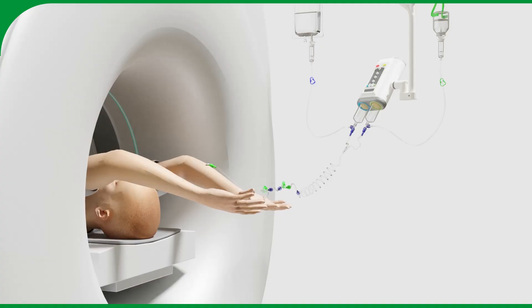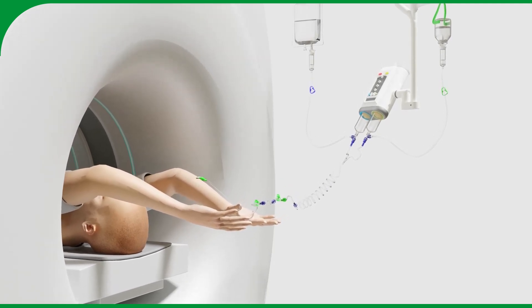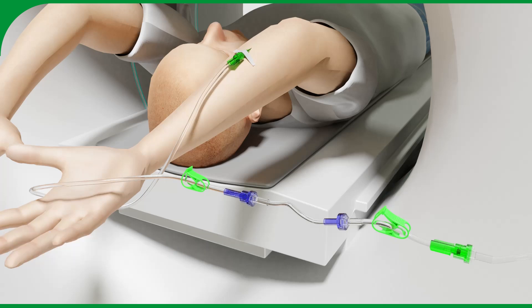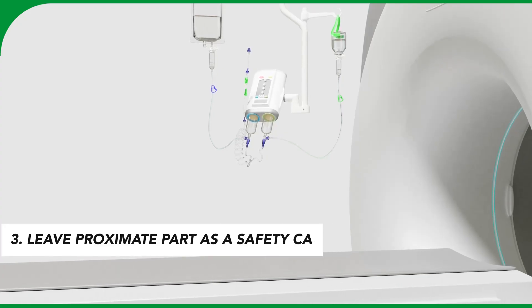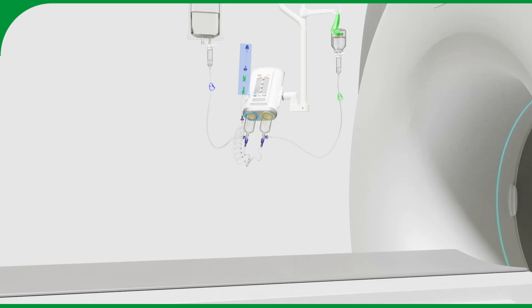After every injecting procedure and before disconnecting the patient, close both clamps on the trans flux to prevent backflow. The patient line can now be disconnected. The proximal part of the trans flux remains attached to the trans set as a safety cap in between patients.